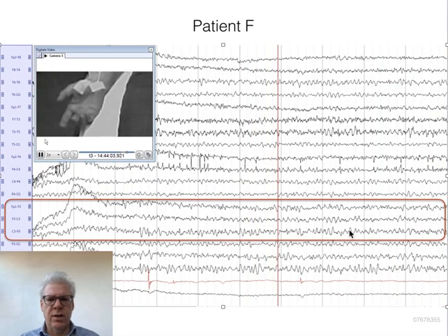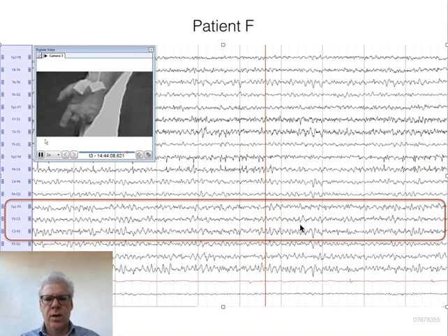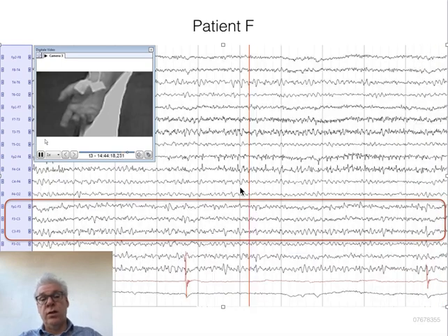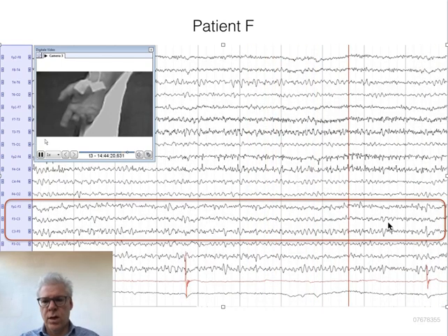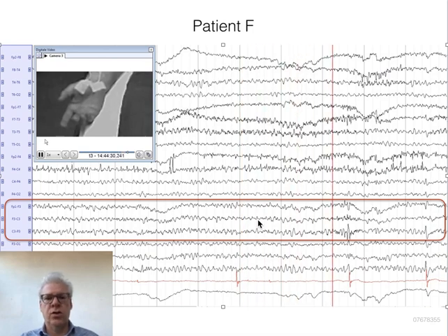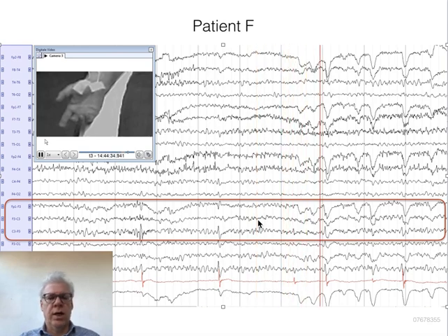Now, you don't have to remember this, of course, or know this in detail as a student, but it illustrates the relevance of the EEG in particular conditions. So these intermittent, short duration muscle jerks find their origin in the cortex and not, for instance, in the spinal cord. Here again, we see this interictal discharge and the response of the patient. Now, this patient also suffered from more severe seizures where this was more continuous. So it's both cortical myoclonia and symptomatic seizures in this patient.